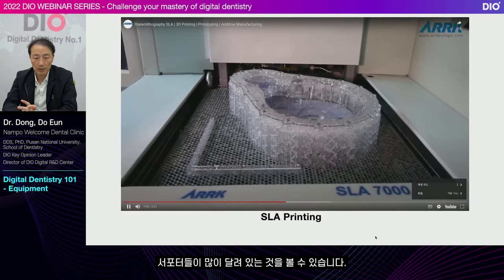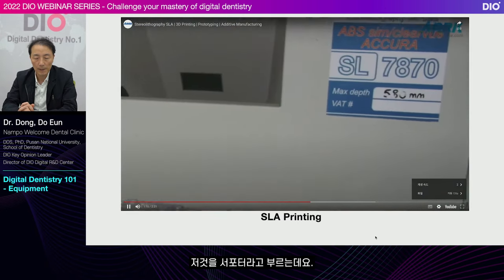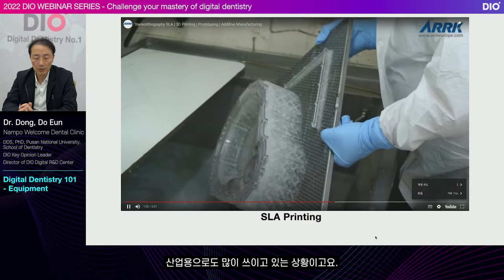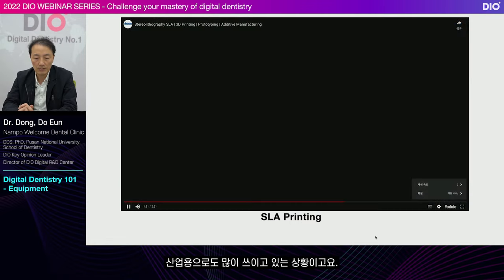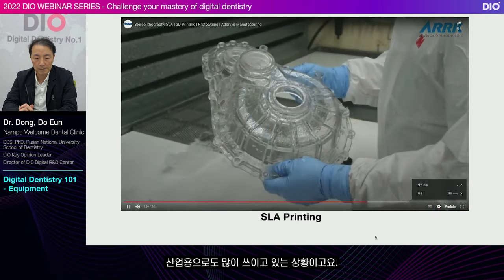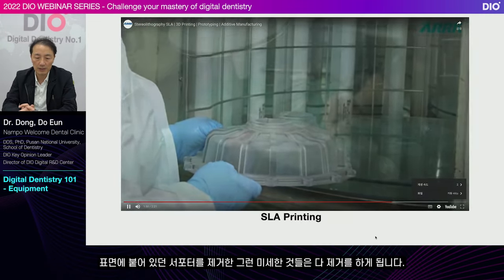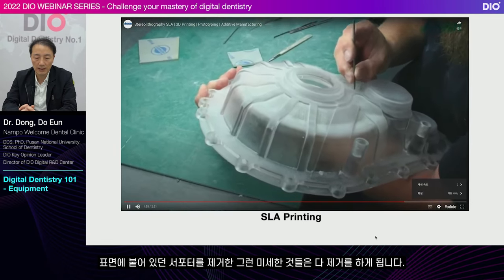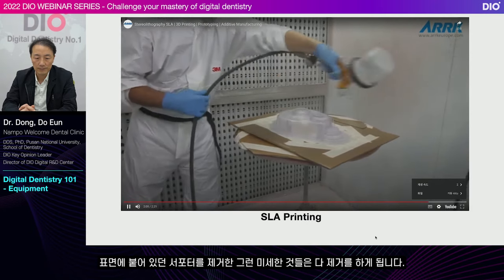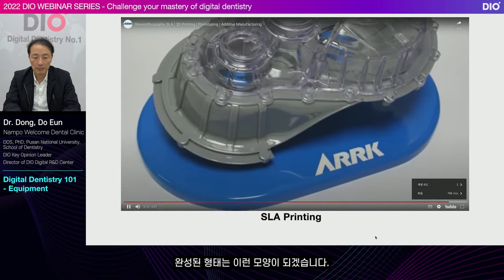You can see that there are many supporters hanging. Those are called supporters. It's used a lot commercially as well. It also needs post-treatment. The supporters on the surface and other microscopic things need to be removed. The finished shape looks like this.